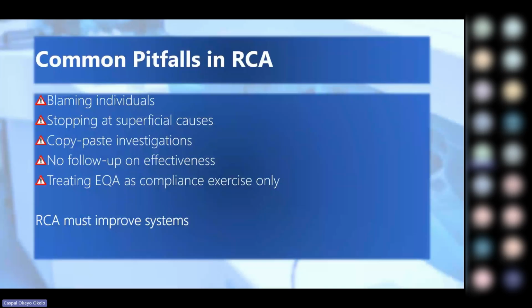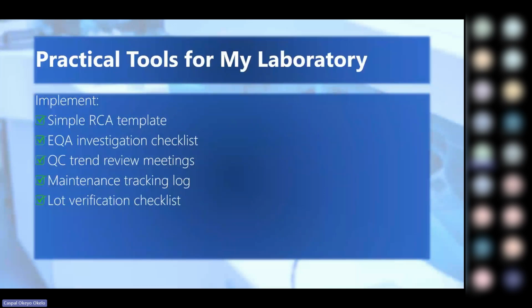And finally, the last common pitfall is treating EQA as compliance instead of improvement. When you view EQA as a regulatory burden, investigations become superficial. But when EQA is viewed as a learning tool, investigations become meaningful, and quality culture always determines the depth of RCA. Now let's move from theory to practical tools.